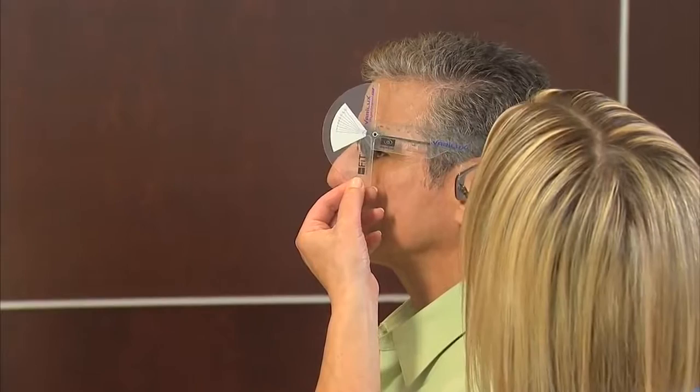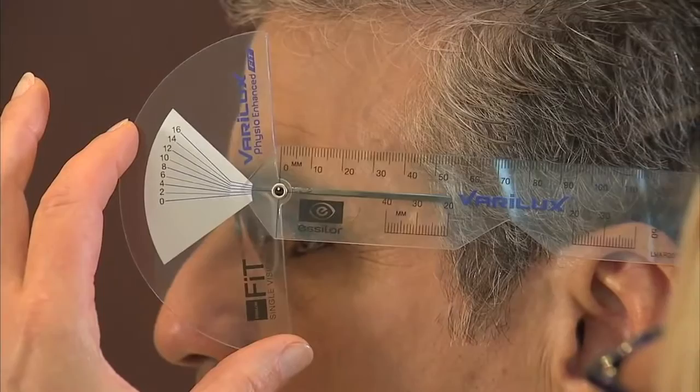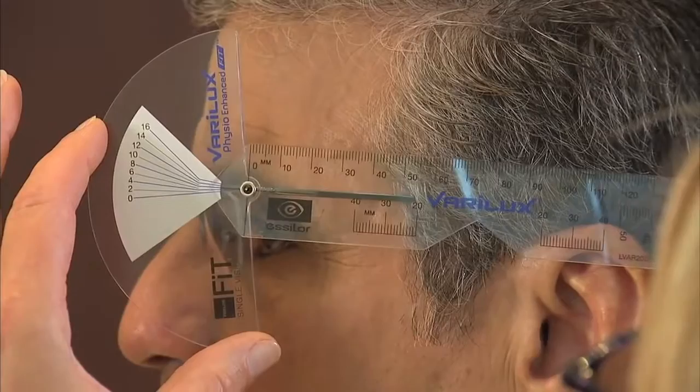Approach the patient's left side to take this measurement. Hold the ruler with your right hand as you align the horizontal line on the tool with the midline of the frame temple. Now that you have aligned the horizontal line with the midline of the temple, slide the tool to your left until the leading edge of the semicircle is aligned with the front edge of the patient's lens. With your left hand, slowly turn the semicircle until the leading edge is fully aligned with the lens. Read the pantoscopic tilt angle by following the line at the tip of the ruler to the corresponding blue or black measuring line.